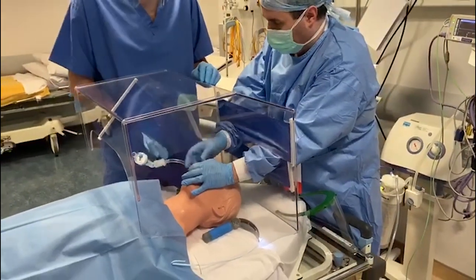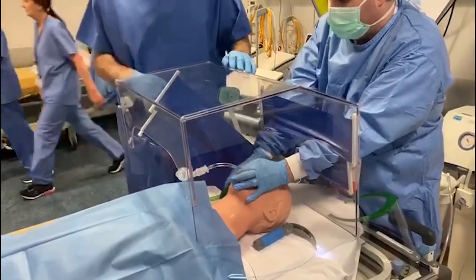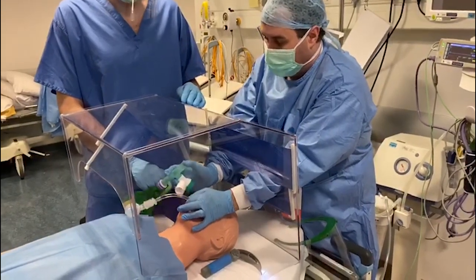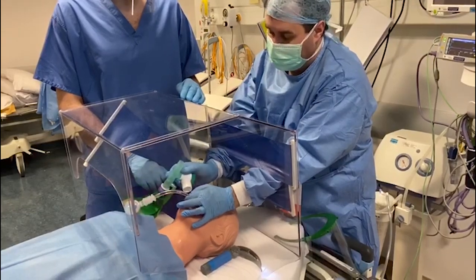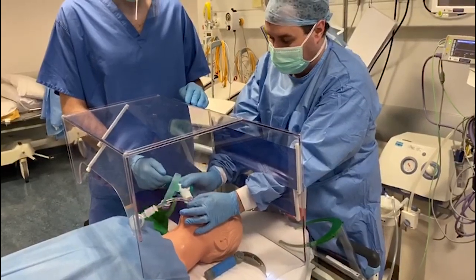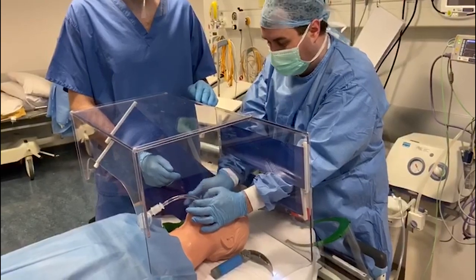The circuit can come out the side or through the little gap here. One thing I would say is to turn off the oxygen flows when you take the mask away from the patient's face, so you're not causing dispersal of what's in the box. When you're not bagging the patient or the circuit is disconnected, make sure the flows are turned off so you're not displacing the aerosol that you've successfully trapped.